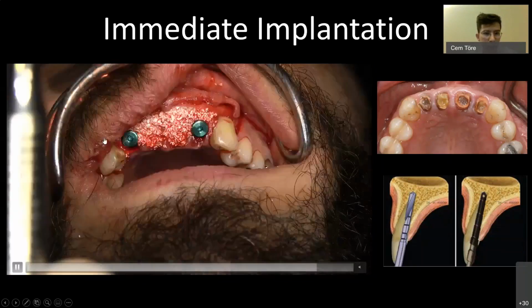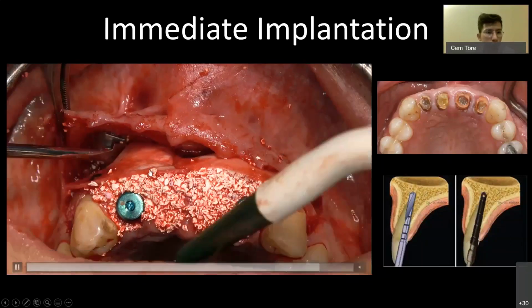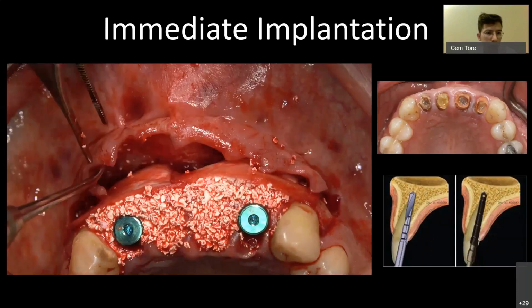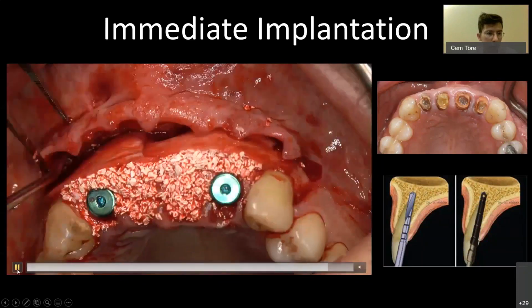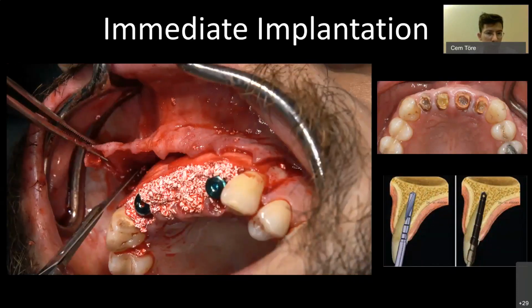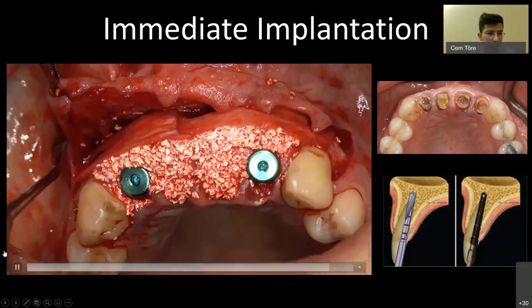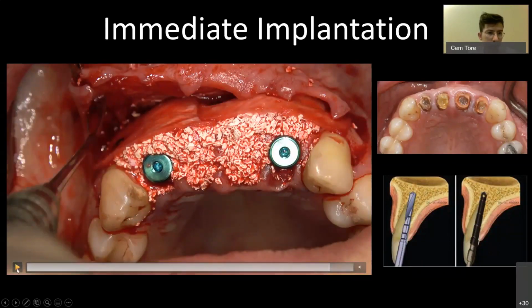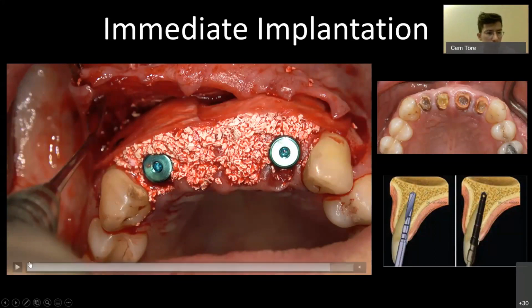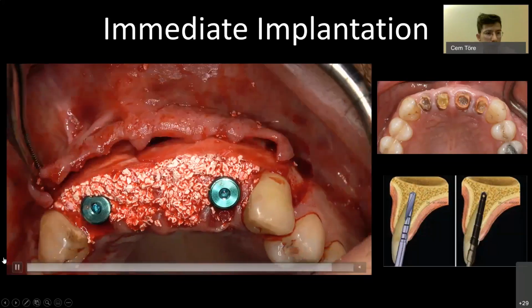And then after we place the incision all the way, we must do what is called a brushing stroke to release the flap. There is a special tool built to do this, but as you can see, we switch to a simpler tool. You can use a periodontal elevator for this. At some point, you will realize, like here, there's a string-like structure that prevents the gingiva, the flap, from releasing. Whenever you see that, go there again with the blade, checking with the back of the blade where it is, and then with the sharp edge make a small incision just on that string that's preventing you from releasing the flap. And when you do that, you will see that side releasing as well.